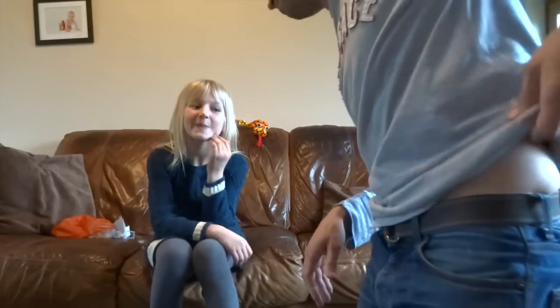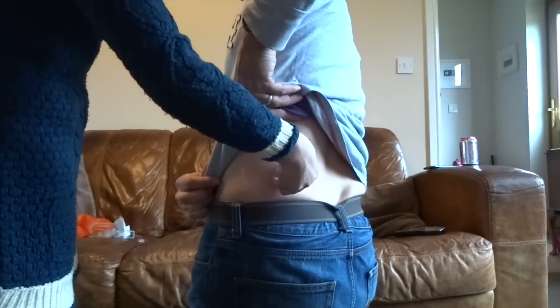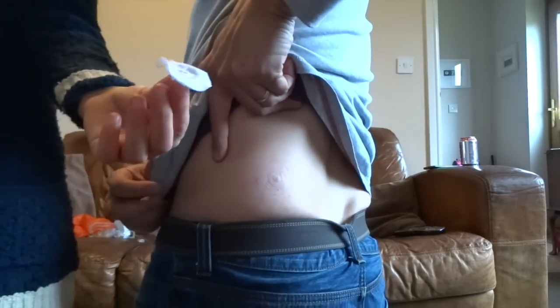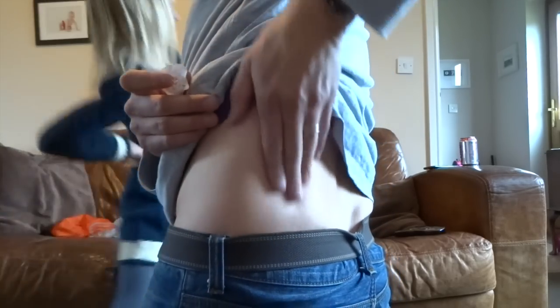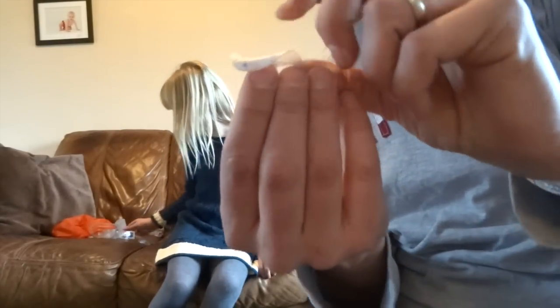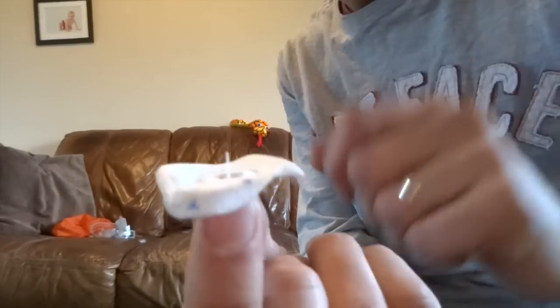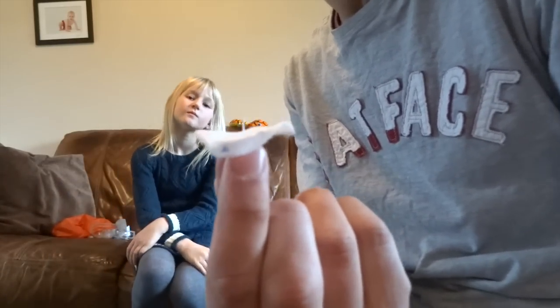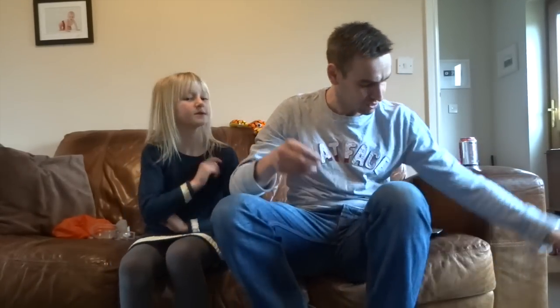So now what do we do with the old one? Take it off — just peel here on this triangle bit, then peel it. It's off. And then you see it starts off all sharp, then it goes plastic. You'll see the old where the set was — give it a quick wipe. Leave a small mark, but they disappear over time. And this little bit here, this is the filament — that's the bit that's left inside your body. That was inside the metal of the sharp before we put it in our body. Rubbish goes wherever it needs to go — sharp's going in the sharp pile.